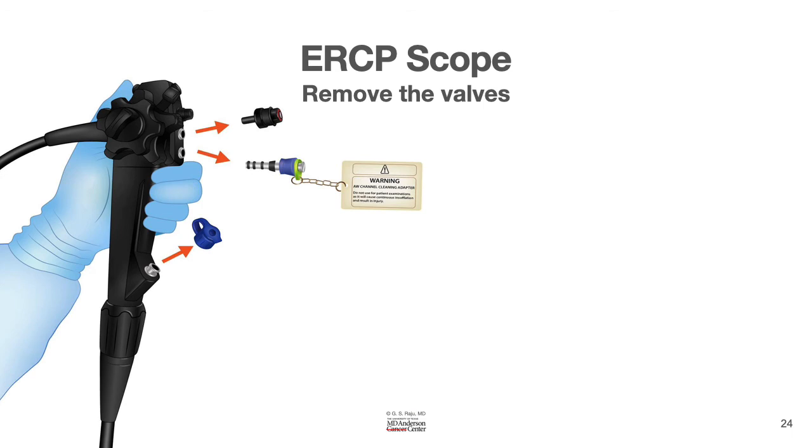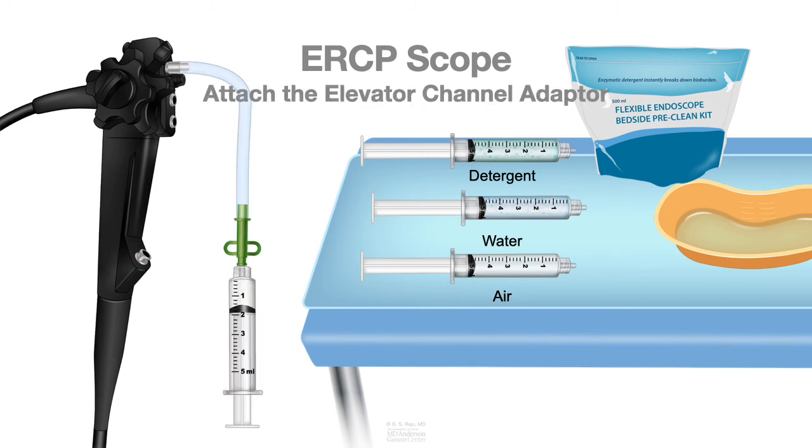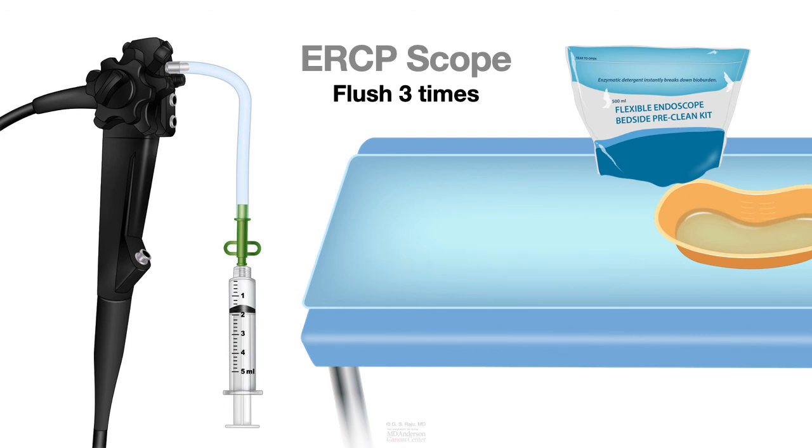Following that, we remove all the valves and attach the elevator channel cleaning tubing, and that adapter is attached. And then what we do is we do three things. We take a syringe full of detergent, a syringe full of water, and a syringe full of air. And we flush the detergent 3 times, then water 3 times, and air 3 times. And it will give a nice clean out of the elevator channel.